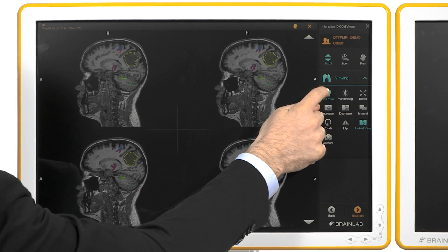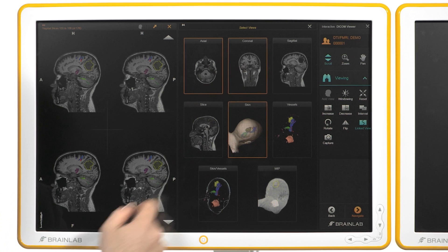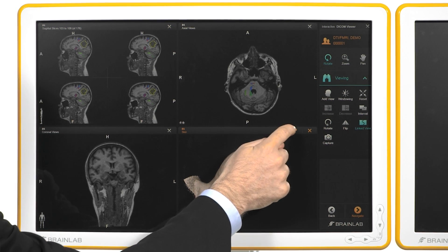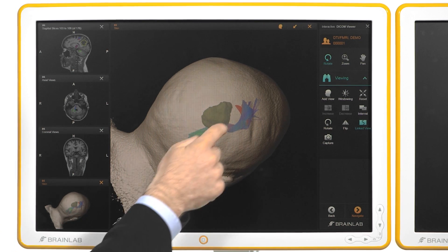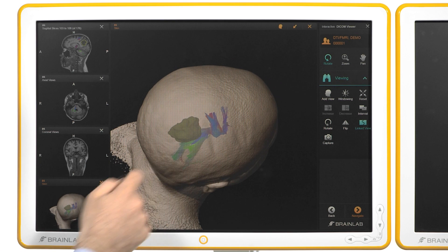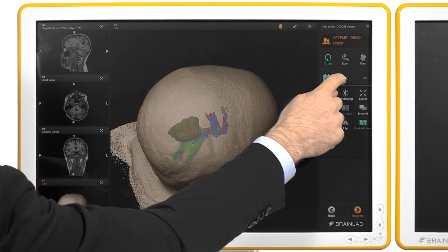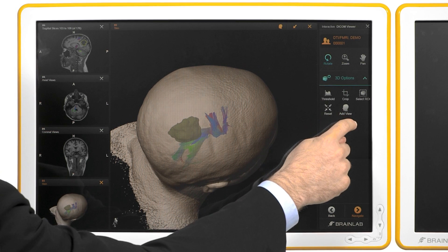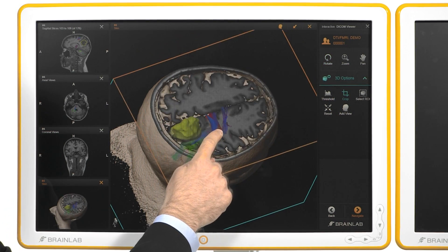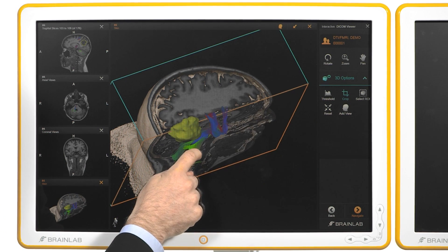Reconstructions are rapidly added by dragging my finger around the options that I would like to display, including 2D and 3D reconstructions. Pinning the 3D view ensures that this is what I want to see in the axial, coronal, or sagittal views.